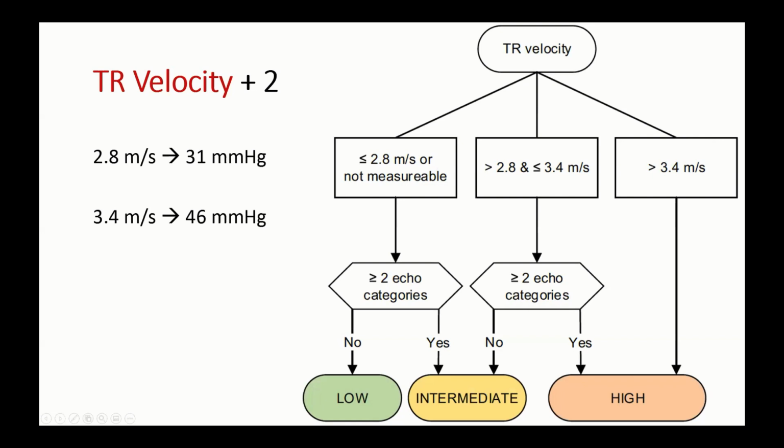All right, so what's more important than the actual measurement of the pulmonary artery pressure is to estimate the risk of the patient of having pulmonary hypertension or not, so that you can decide, does the patient need a right heart cath, to actually measure the numbers. So the ASE has a setup where you can do this reasonably well using the point-of-care ultrasound.